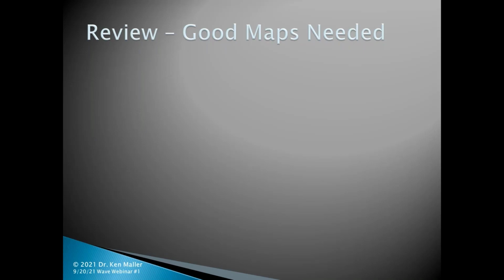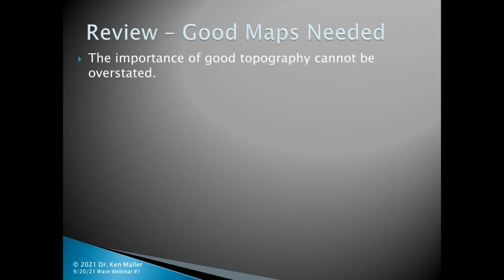And so clearly this was all related to the original design being skewed because the topography was bad right from the start, and it gave me bad data to start with. And that's despite my knowing what to do with wave, it didn't matter. You still end up with a bad fitting lens. So the importance of good topography cannot be overstated. It really is very important to become critical and discriminating about getting good topographies to start with.